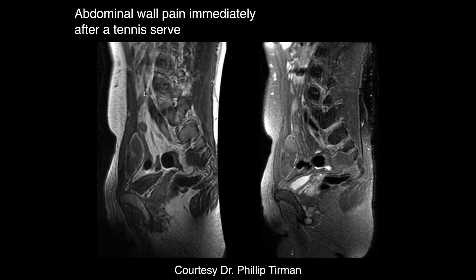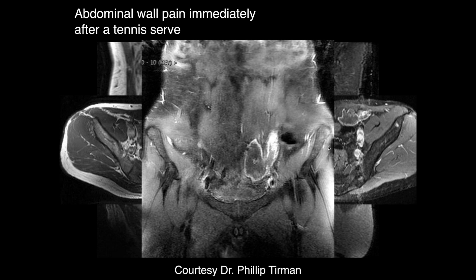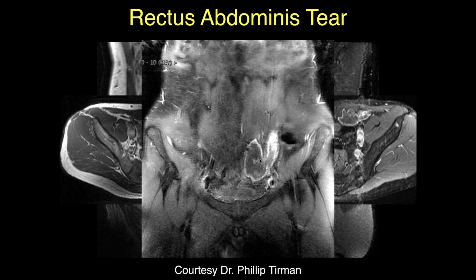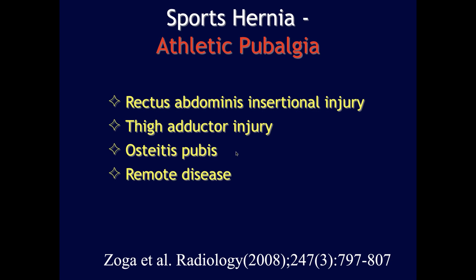A case of abdominal wall pain after a tennis serve. There is a circumscribed collection deep along the rectus abdominis, consistent with a large hematoma from a significant abdominal wall tear. This leads into the topic of sports hernias — better termed athletic pubalgia — which are acute or chronic injuries near the symphysis pubis involving the distal rectus abdominis insertion.